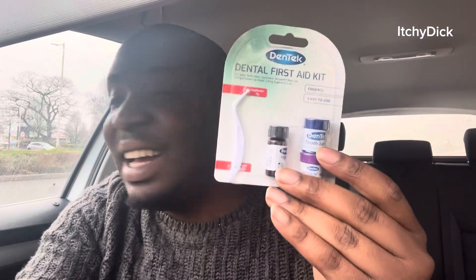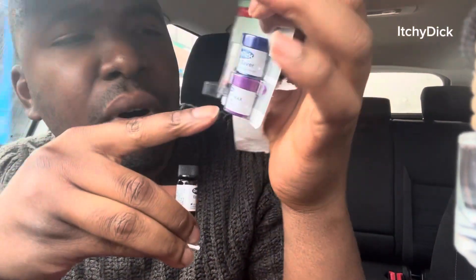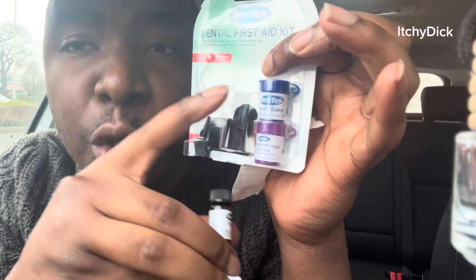Sorry about it being in my car because yeah, I'm just working. So yeah, that's the kit. I'll just give you a brief tutorial on what these other ones are for. So this is a tooth saver — in case you want to save your teeth, you put it in here.